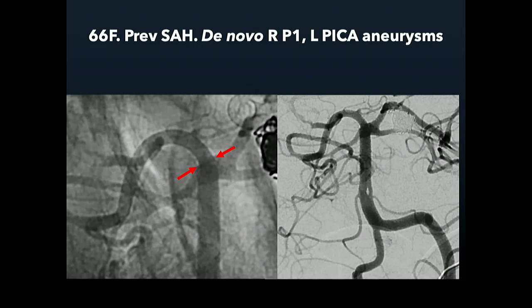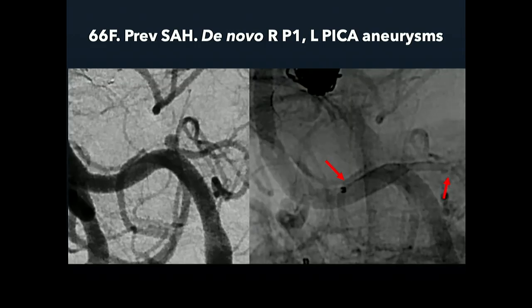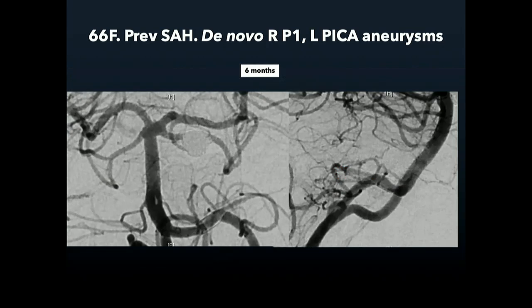and sits nicely across there. And then turned our attention to the PICA aneurysm, and it actually proved impossible to get into the PICA from below, from the left. So we switched to the right and came from the right down the PICA from right to left, and then delivered the Silk Vista Baby there. So you can see it going from narrow and constrained in the PICA to nominal diameter in the vert. And this is the follow-up at 6 months. So the aneurysms, both aneurysms are gone, and the stents are nicely patent.